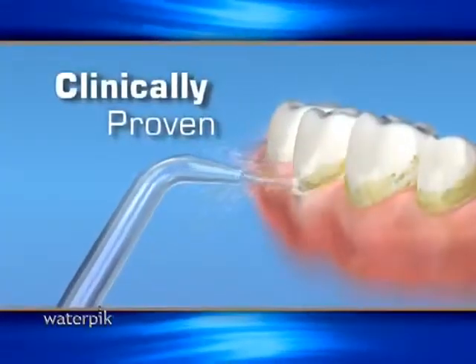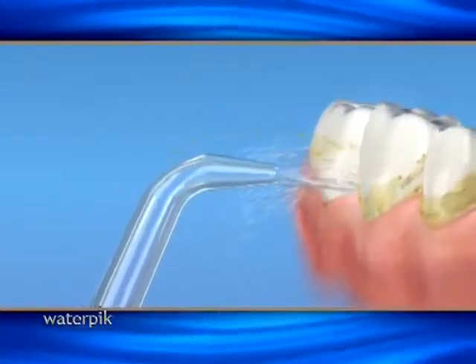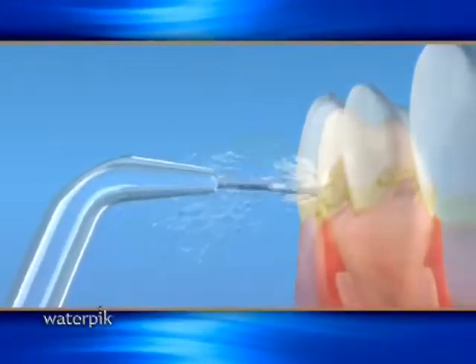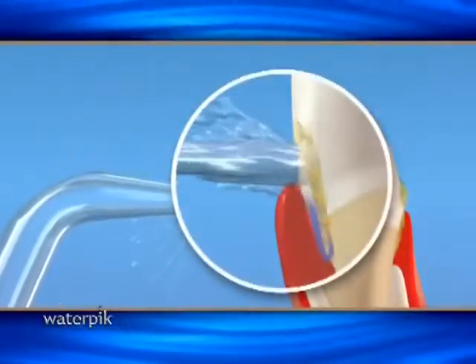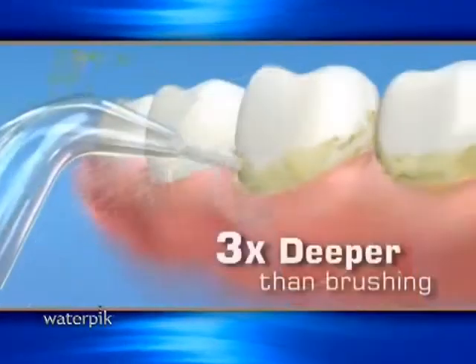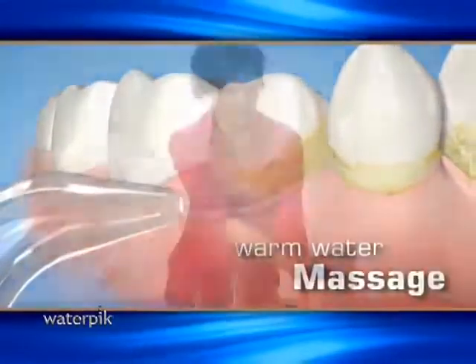The Waterpik uses a clinically proven, precisely controlled combination of water pressure and pulsations to clean deep between teeth and below the gum line, removing debris and harmful bacteria from hard to reach areas. It cleans three times deeper than brushing alone, while it massages the gums, leaving your mouth cleaner and more refreshed.